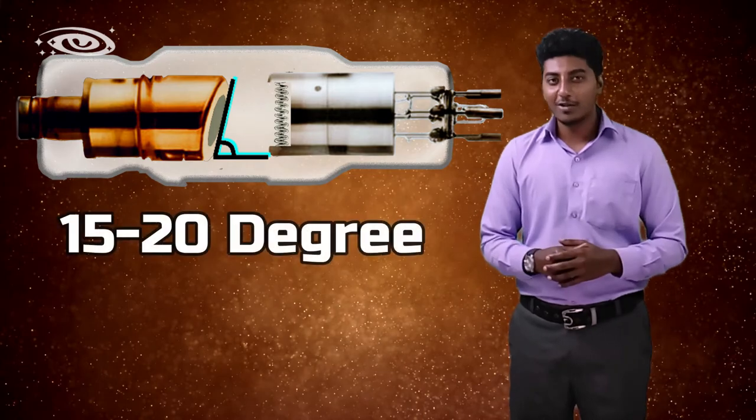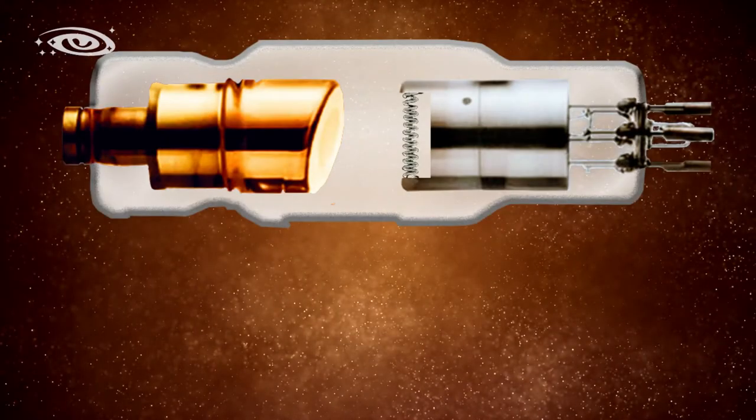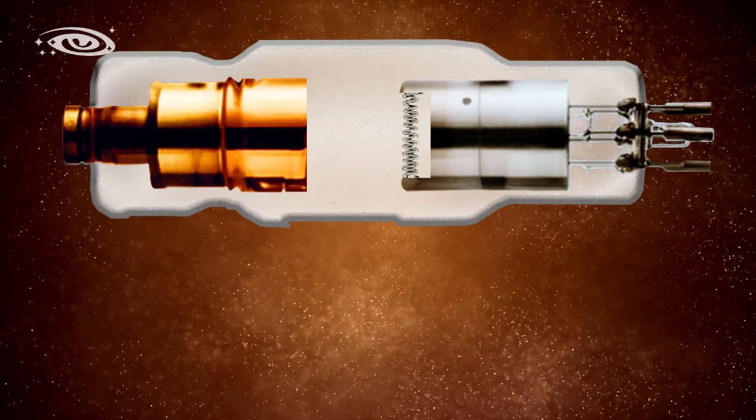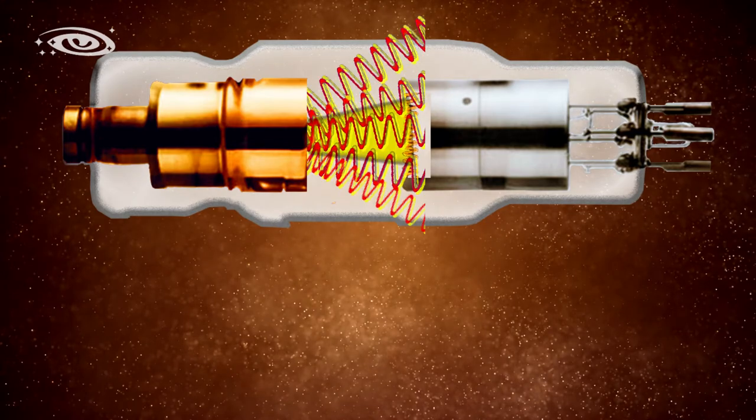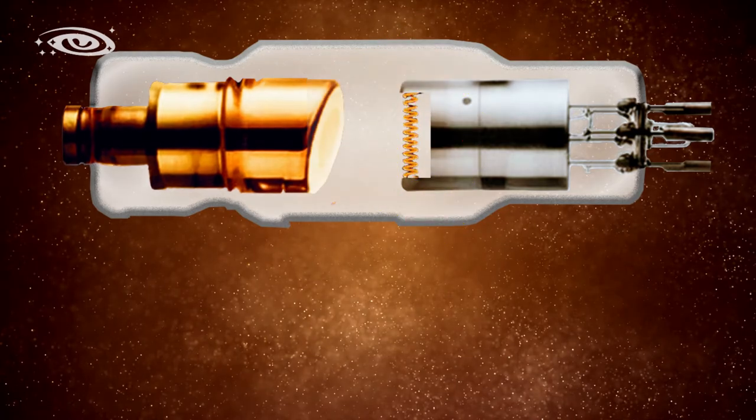The anode angle is usually 15 to 20 degrees in the stationary anode x-ray tube. The reason for the anode angle is to radiate the x-ray beam perpendicular to the high velocity electrons. If the anode is flat without angulation, the x-ray photons will radiate opposite to the cathode side, making them useless. To overcome this, an angle is given to the anode.